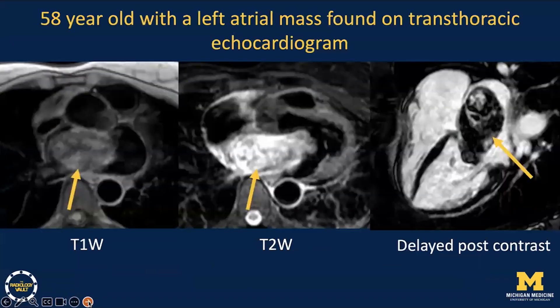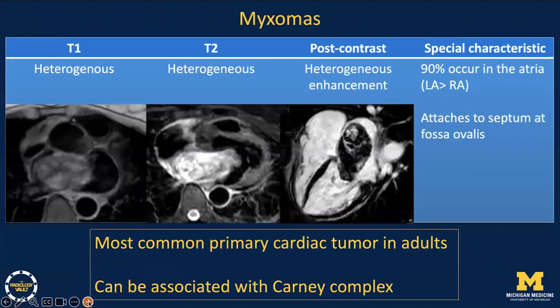This is a 58-year-old with a left atrial mass found on echo. The diagnosis in this case is a myxoma, which is the most common primary cardiac tumor of the heart. The key to diagnosis is the location, with 90% of myxomas occurring in the atria, most commonly the left atrium at the fossa ovalis, as we see in this case. T1 and T2 signal are variable, and enhancement is also often heterogeneous.